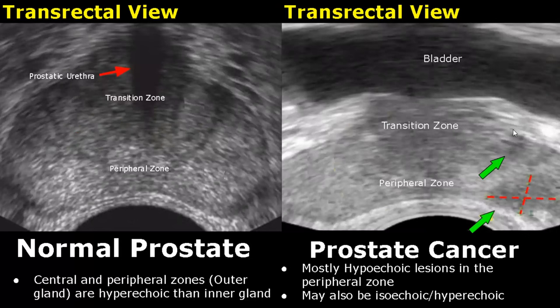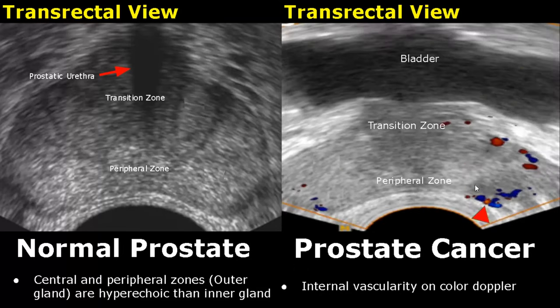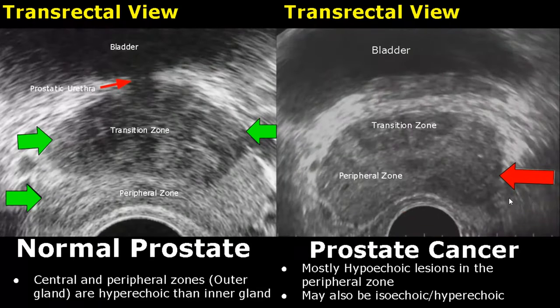Prostate cancers mostly occur in the peripheral zone. They usually appear hypoechoic, but in some cases can appear isoechoic or hyperechoic. On color Doppler, we will see internal vascularity with Doppler signals inside the masses. Here is another image of prostate cancer — a hyperechoic mass is seen in the peripheral zone.